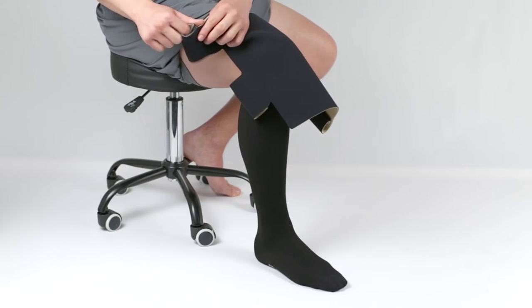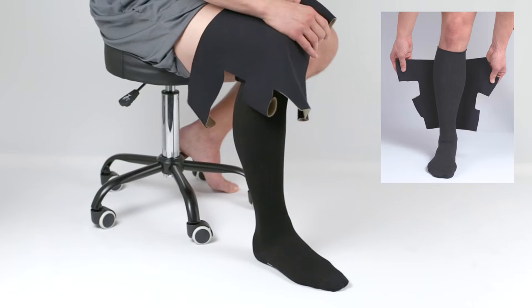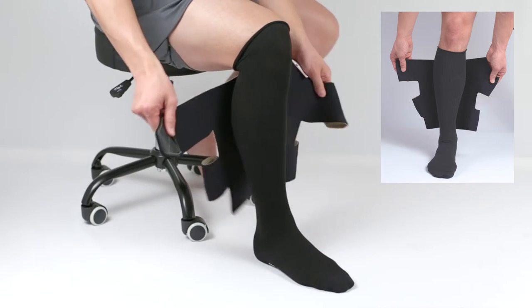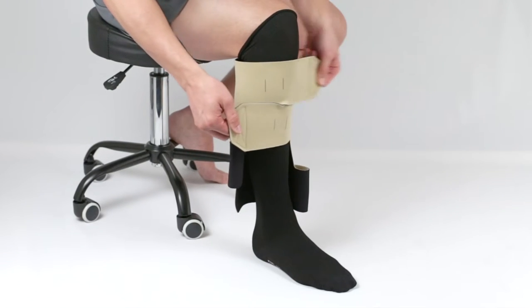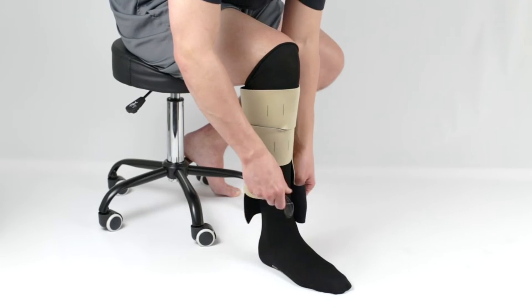Align the CircAid JuxtaLite just over the ankle bone and just below the knee crease. The black side of the material should face the skin. Unroll the top two bands and loosely secure them to the outside of the garment to anchor it in place. This enables you to easily raise or lower the garment for correct positioning.